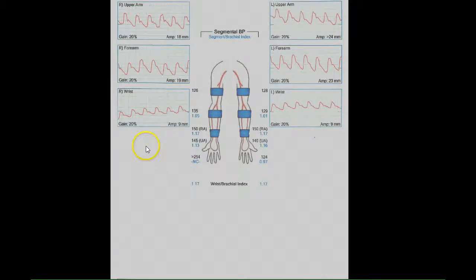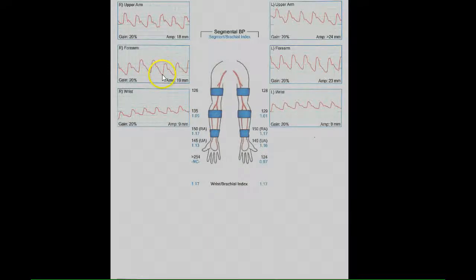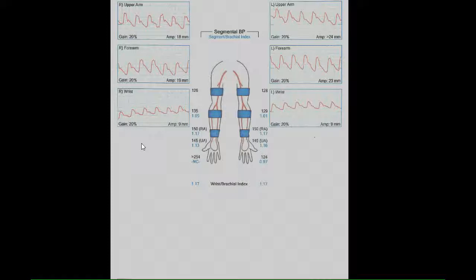Next, we will look at the pulse volume recording waveforms, which demonstrate a sharp upstroke and dichrotic notch at all levels bilaterally. This also indicates normal flow.